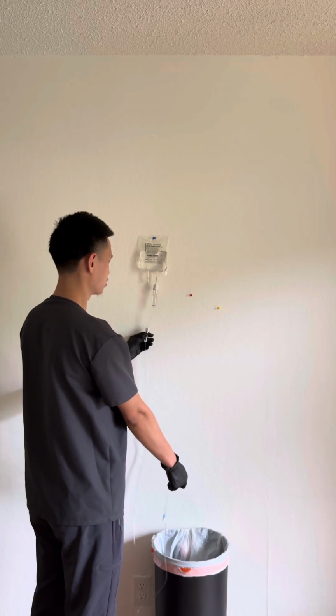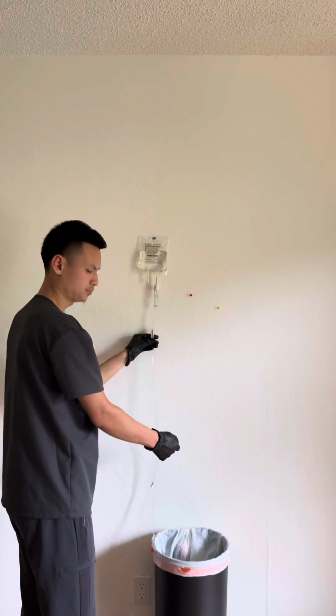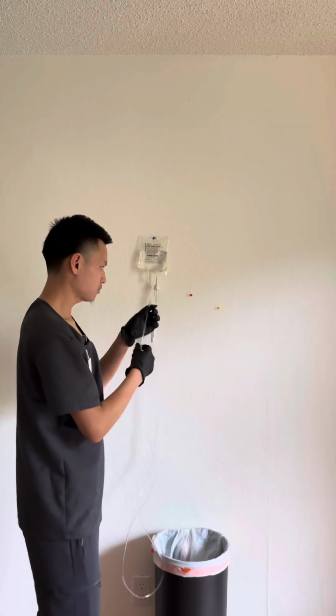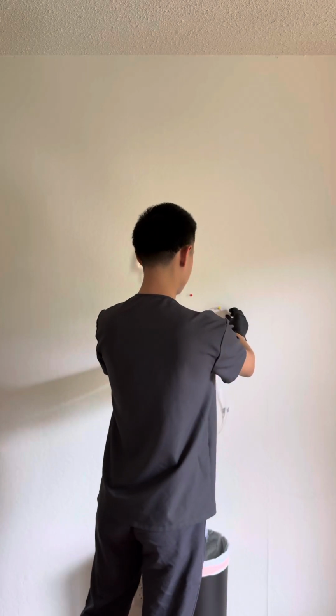Okay, so that is 38 drips. I'm going to roll the clamp back to the off position and place the cap back on. Then I will hang the excess tubing to the side.